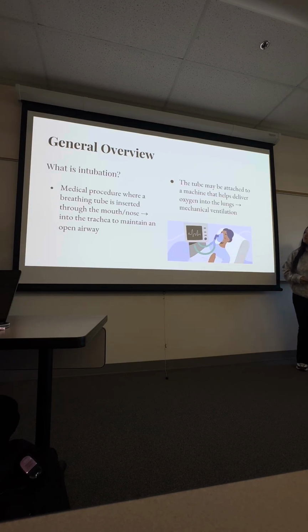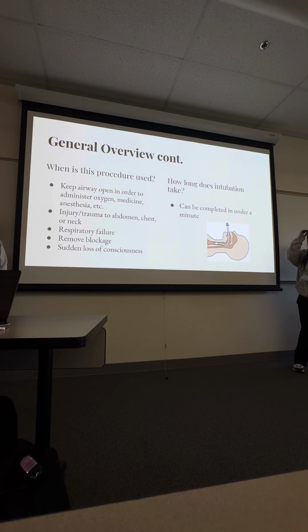Okay, so a general overview, as Nikki kind of said, so what is intubation? It's a medical procedure where a breathing tube is inserted primarily through the mouth or nose down into the trachea to maintain an open airway, and the tube may be attached to a machine that helps deliver oxygen into the lungs, which is known as mechanical ventilation. And when is this procedure used?